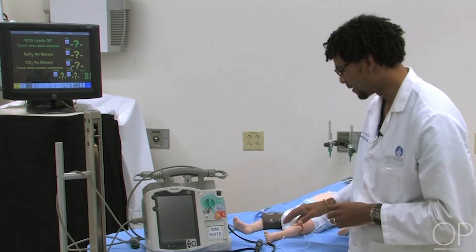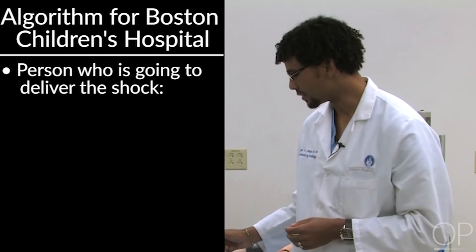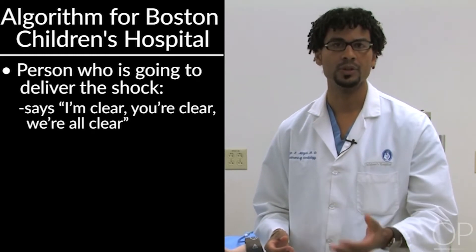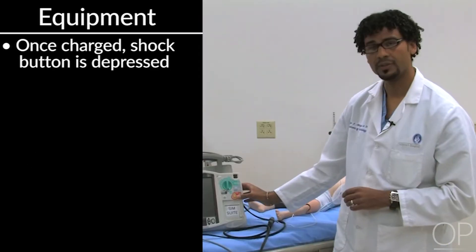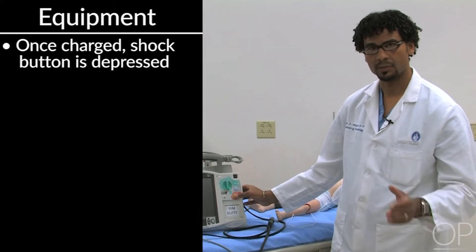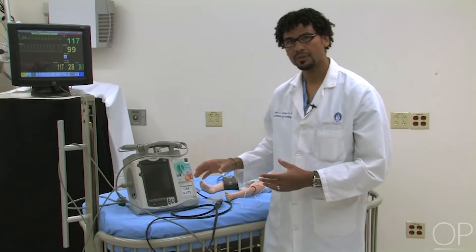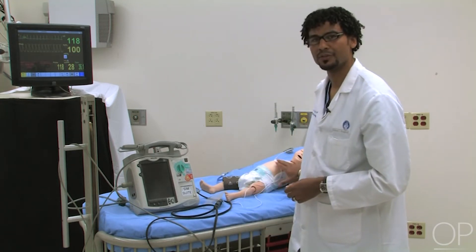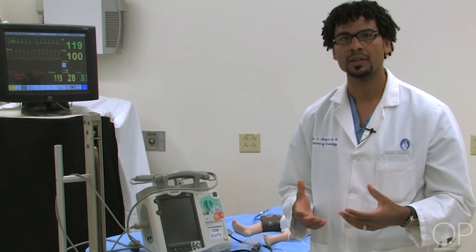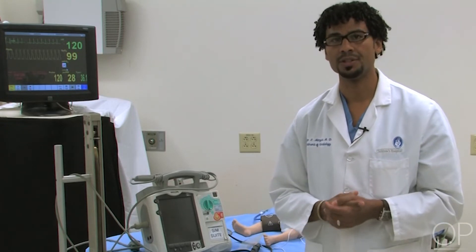A shock will conduct through the patient and into any caregivers still in contact with the patient. The algorithm involves the person delivering the shock saying: 'I'm clear, you're clear, we're all clear,' then waiting for an affirmative before delivering the shock. When the device is charged and all caregivers are clear, the shock button is depressed and a shock is delivered. If you arrive at the bedside and the patient is already in ventricular fibrillation without pads placed, immediately initiate CPR to support cardiac output until you are in a position to defibrillate.